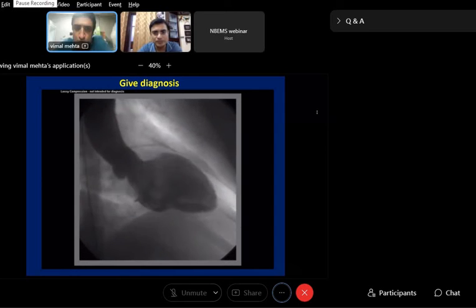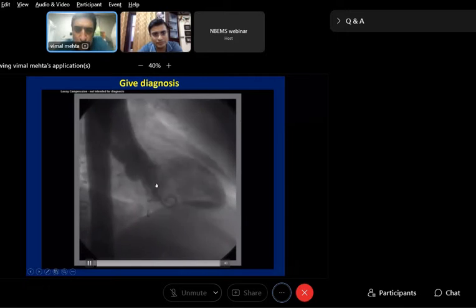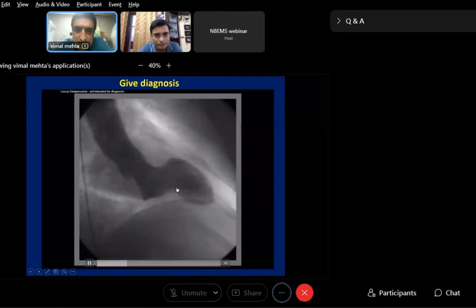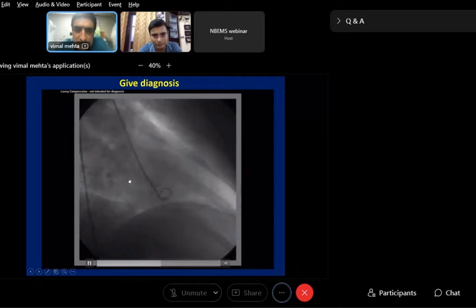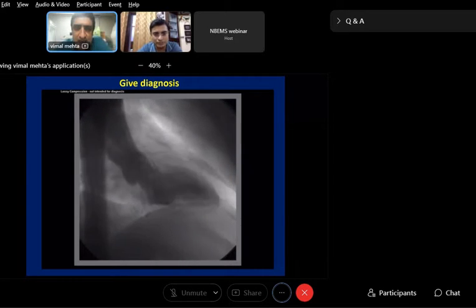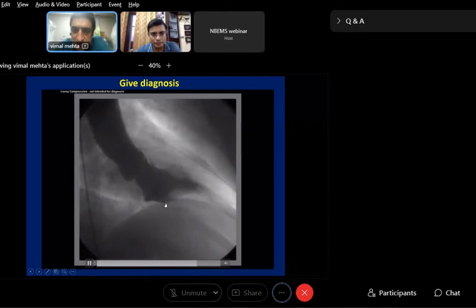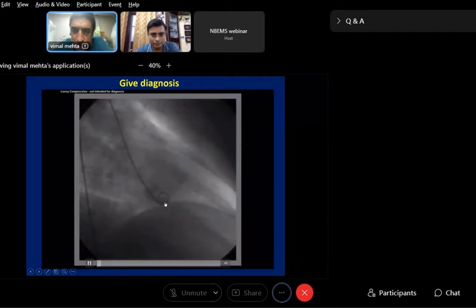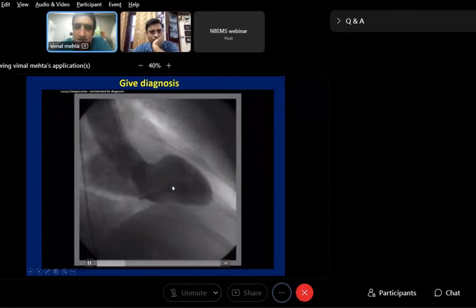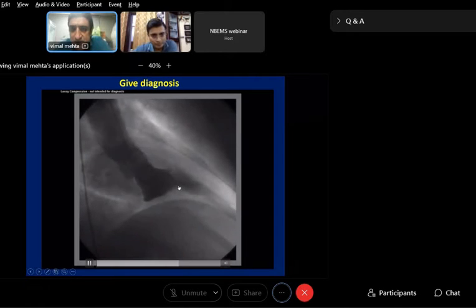Give full marks because this is severe mitral regurgitation, and you can see the mitral valve to some extent, a little bit, and this is opaque. We will go to the grading later on. So this case was iatrogenic MR because the catheter was too near the mitral valve. It is over here. That is also one of the reasons, it is too near the posterior wall and posterior surface of the left ventricle, and that's why we are having so many ectopics.